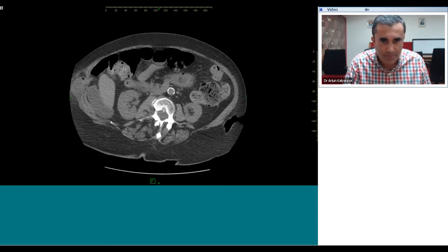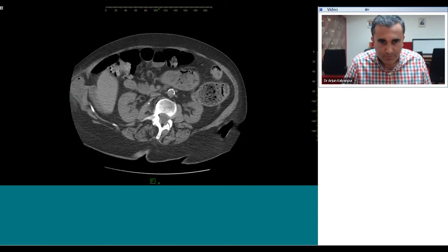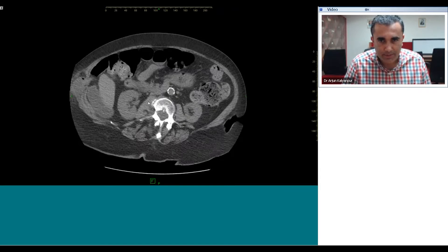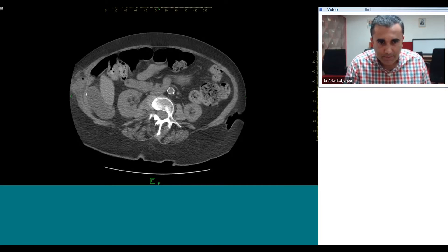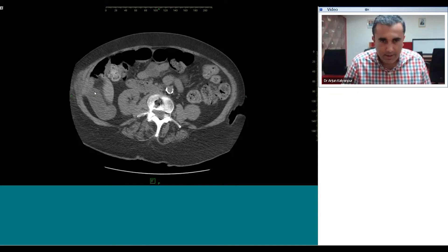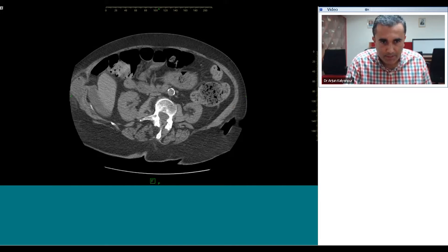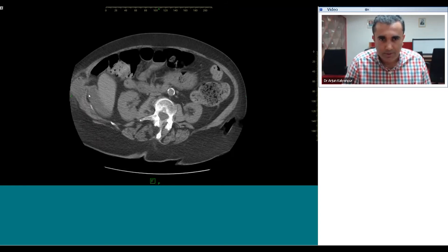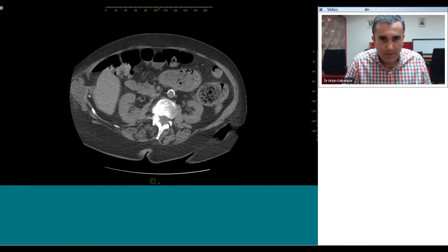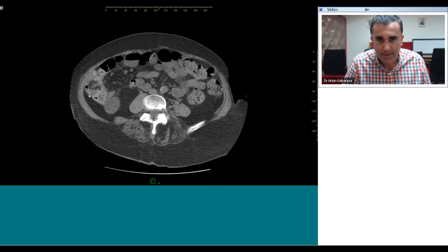This is an example of a strangulated or incarcerated right flank ventral hernia. This is in fact a subtype of ventral hernia called an interparietal hernia, which occurs between the layers of muscle in the abdominal wall — in this case the internal and external oblique muscles are separated by this hernia. So this is a strangulated interparietal hernia of the right flank resulting in small bowel obstruction.